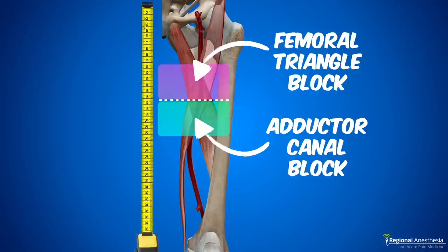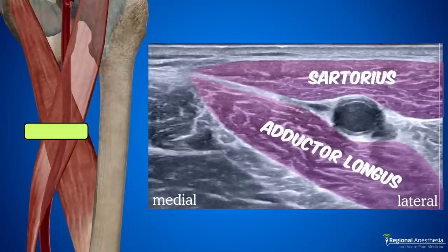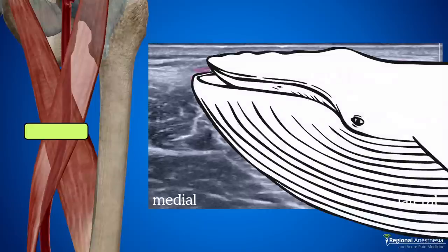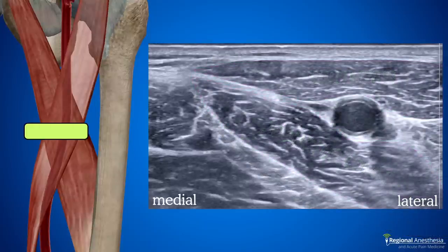We just want to do the block at about the midpoint between the inguinal crease and the top of the patella. If we place our probe exactly at the apex of the femoral triangle and image the femoral artery, we'll see that the medial edges of sartorius and adductor longus meet here — it looks a lot like a whale with the artery as the eye. Once you've seen it, you'll never not see it. And it's no fluke — it's a fantastic landmark to get you started.